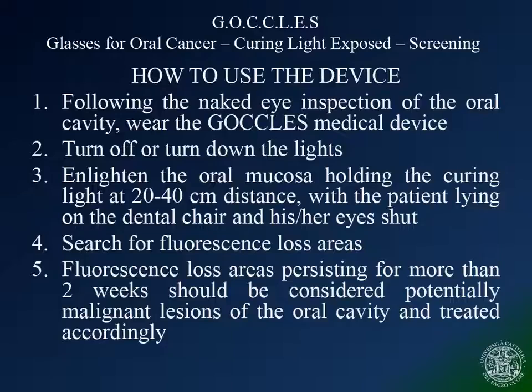Remember that fluorescence loss areas persisting for more than 2 weeks with no apparent reason should always be considered as potentially malignant lesions of the oral cavity and therefore treated accordingly.